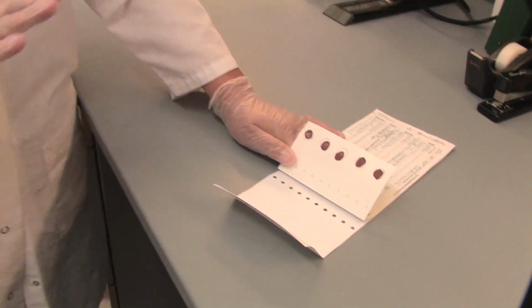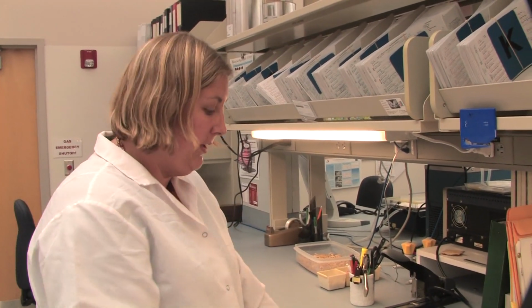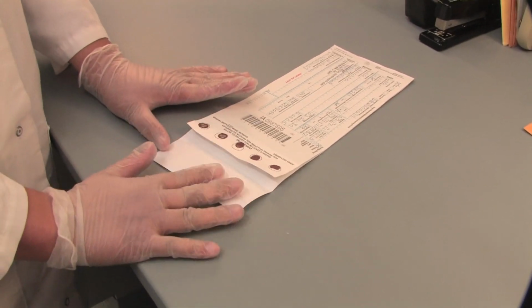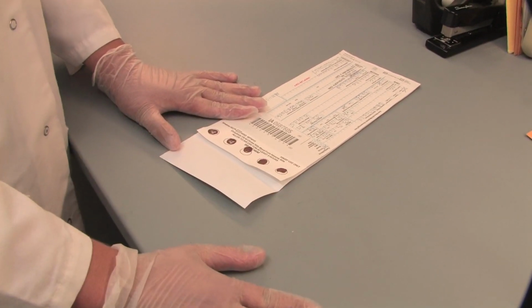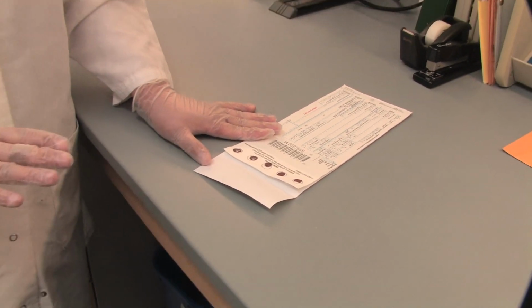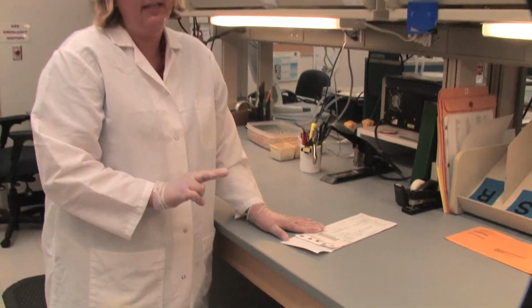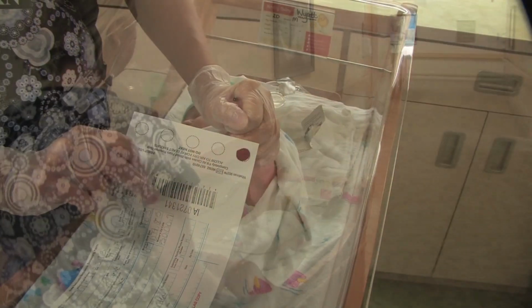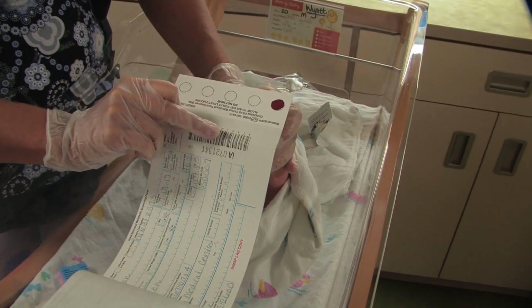And if both sides are okay, then the specimen is passed along based on one person's assessment of the blood. However, if one lab staff member looks at this and says, I don't know, I think there's something wrong with this, the specimen is then independently evaluated by a second lab staff member, and based on their evaluation of the blood spot card, if both agree that it is poor quality or unsatisfactory, it is then assigned poor quality or unsatisfactory. By following these important procedures, you are a critical first link to a healthy start in life.